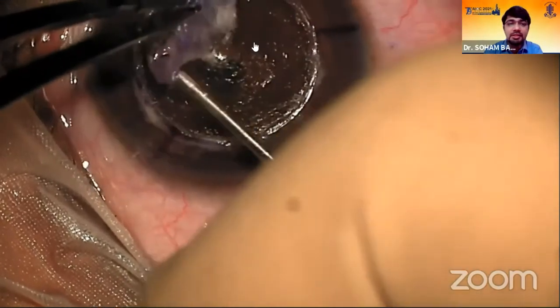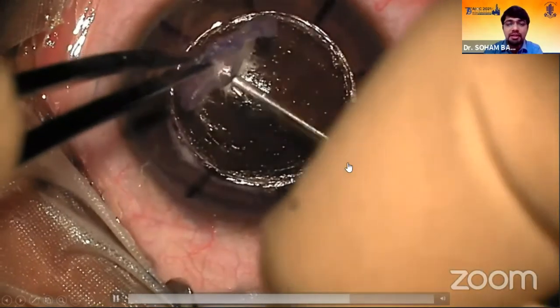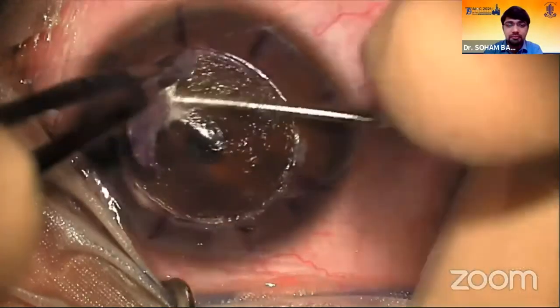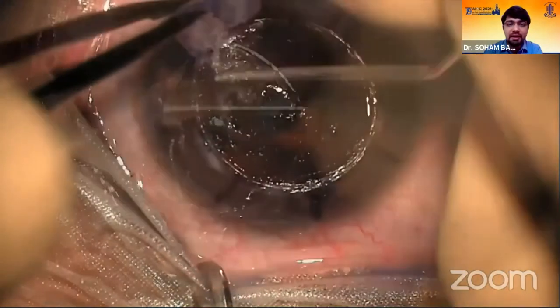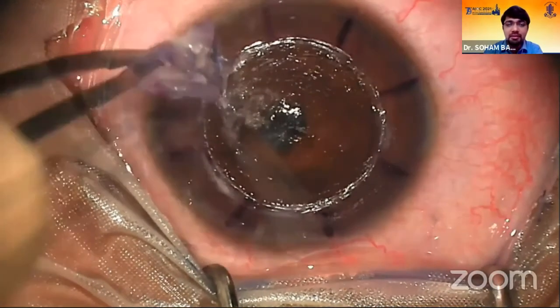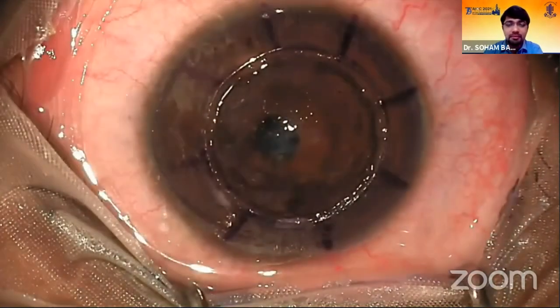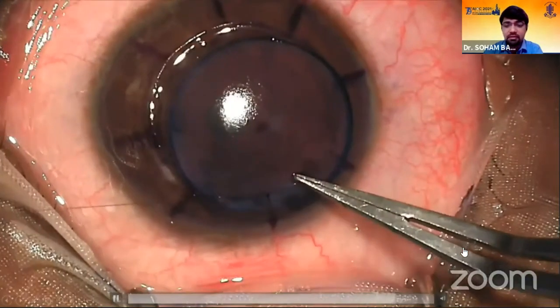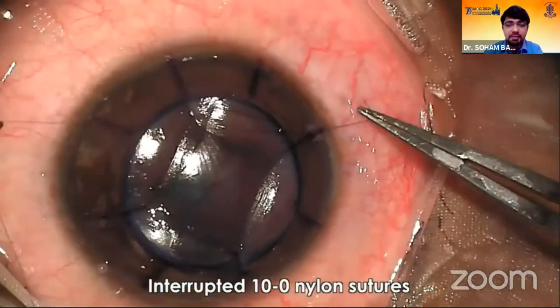And again, this change in reflex to a more shiny one indicates that you have reached close to the Descemet's membrane. So as tempting as it might be, sometimes it is better to leave behind some of these residual fibers, because trying to be perfect sometimes lands you with more complications. Again, similar interrupted 10-0 nylon sutures to secure the graft in place.